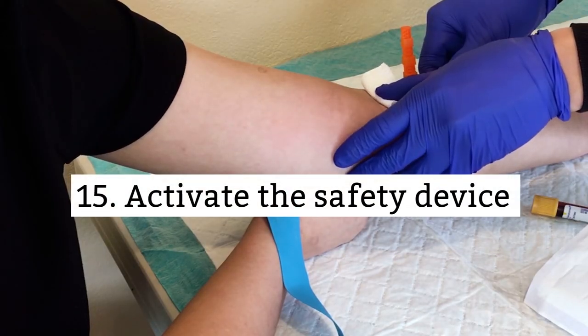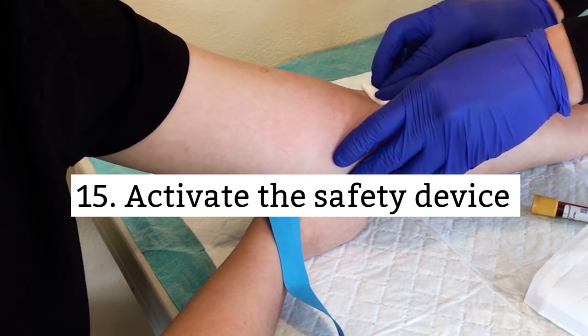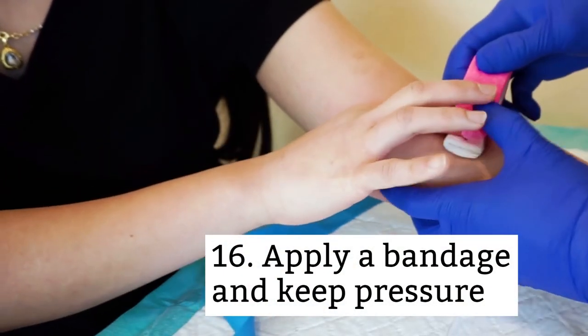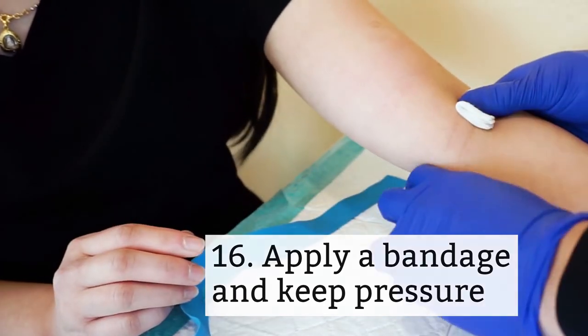Fifteen, once the needle is out of the patient's arm, activate the safety device immediately and throw the needle away in the sharps container. Sixteen, put a bandage on the patient, then ask the patient to keep pressure on the site for about 10 minutes.